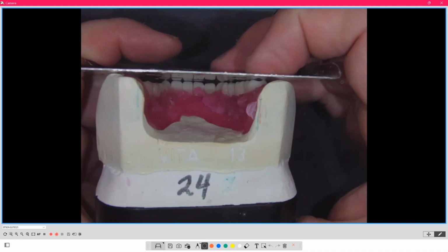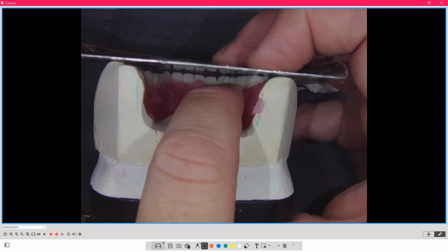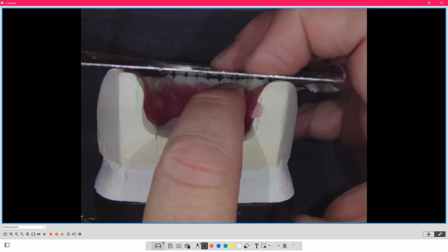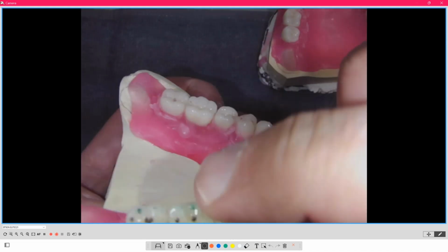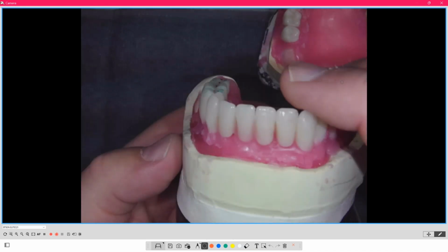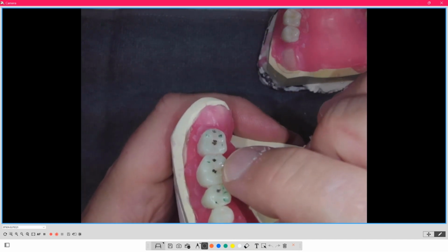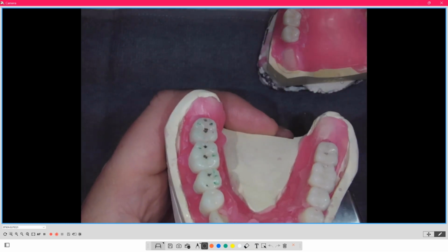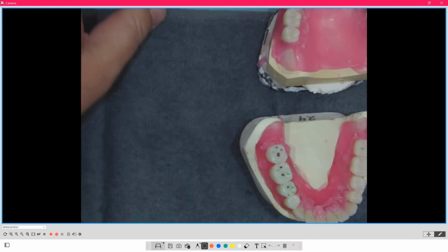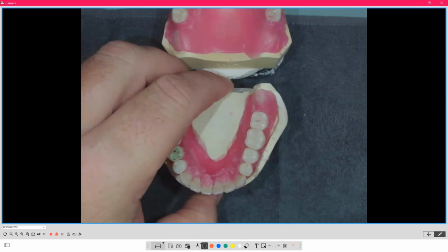So typically, to answer your question, my dear colleague, yes, on the molars, flat. So you should have all the cusps touch flat, so that the lower sits flat, from that Curve of Wilson perspective, okay? Anything else is designed internally in the tooth, but the cusps would touch, okay? I hope that answers your question. If it doesn't, type it back to Jim for any clarification.